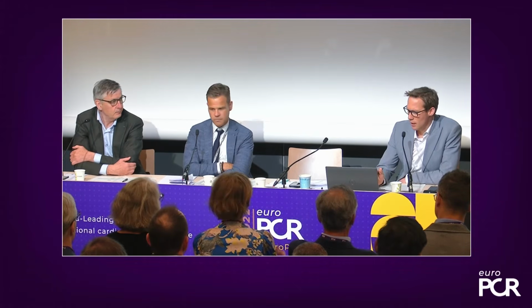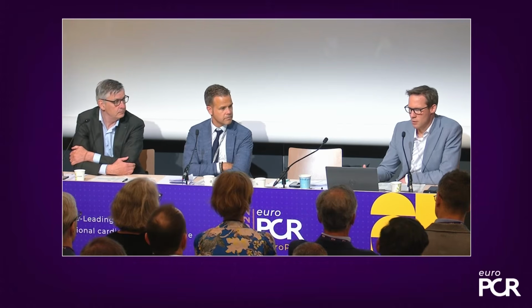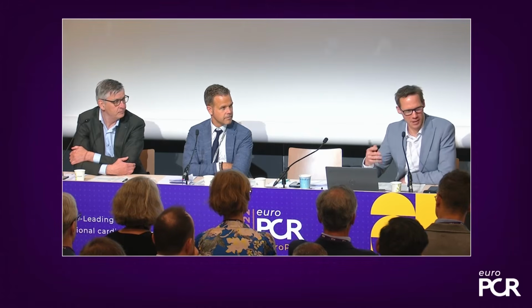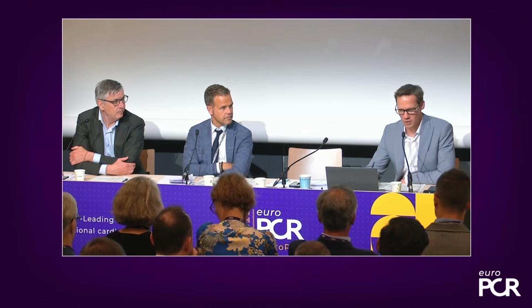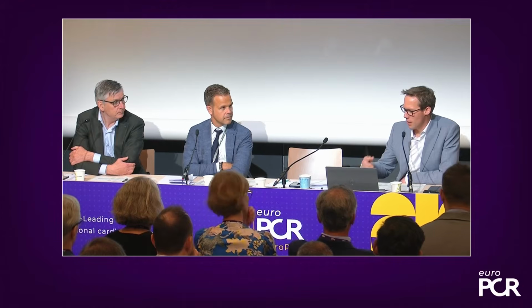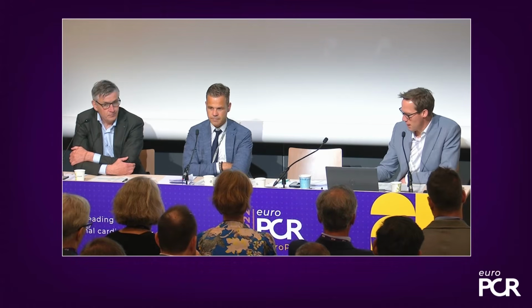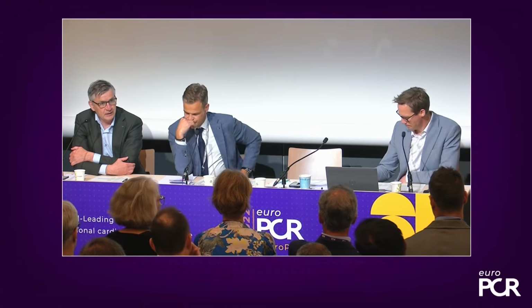So Lars, most of us who do these procedures are all used to going RAO caudal, RAO cranial, let's take a picture, let's take another picture, which view is best. All of that hassle seems to have been taken out of the procedure by the pre-procedural planning. Exactly, because you know from the CT scan exactly where to position your C-arm in order to be perpendicular to where you want to see it, to elongate your landing zone.